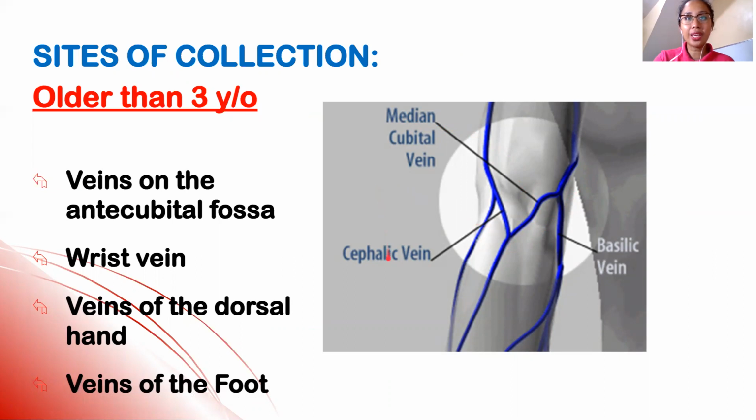Yan. So, cephalic vein. So, cephalic vein dito sa may tapat ng thumb. Yan dito sa area to. So, cephalic vein, I recommend it when the person is slightly obese. Yan, okay ang cephalic vein. However, the disadvantage is it rolls. Yan, it's not that well anchored compared to yung median cubital vein.